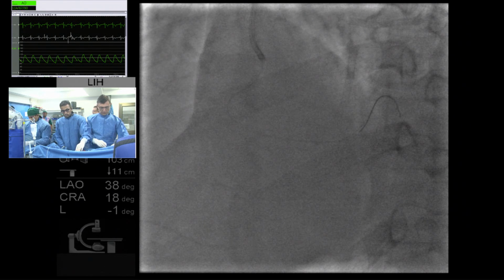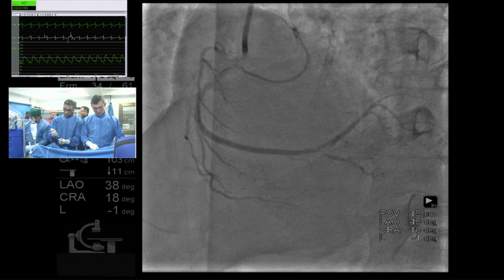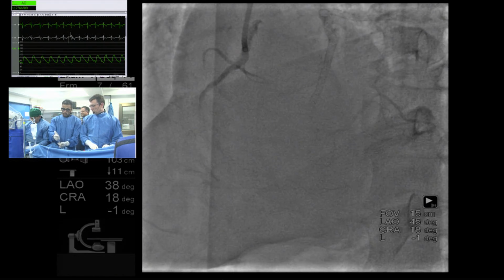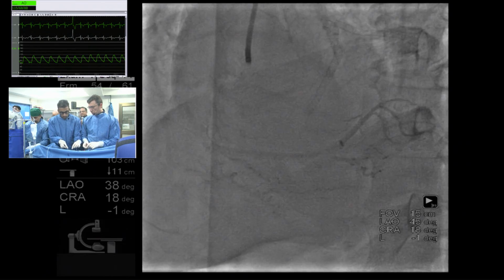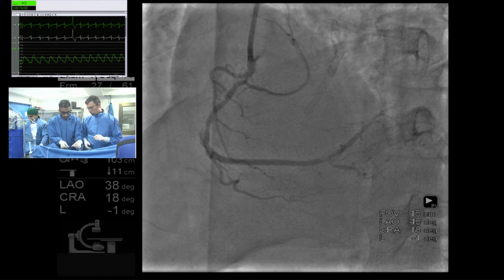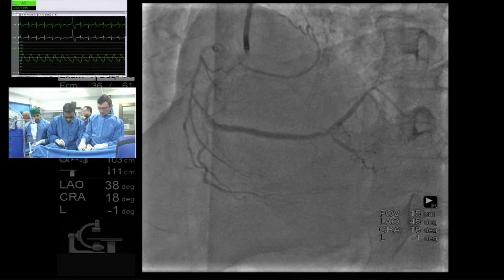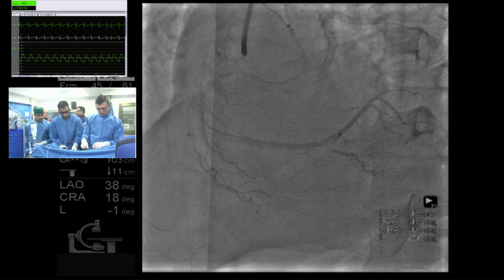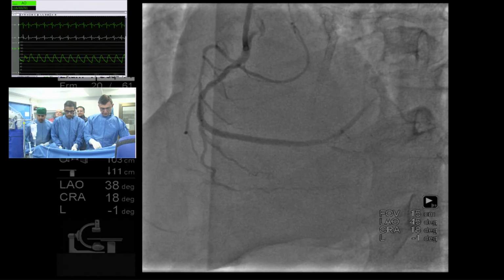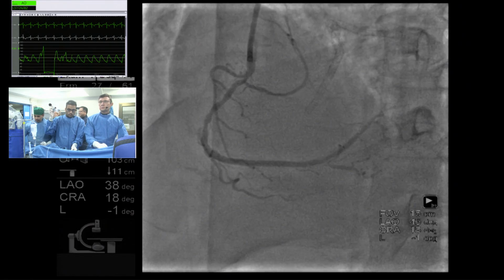So then you yourself will pick certain cuts and do manual measurements? Yes, I basically believe the automatic measurement, but it is very important to pay attention to the vessel shape and also the tortuosity, right? And when you put the cursor to that portion, if it is perpendicular to the vessel, it might be correct. Yeah. And if you can't identify the media or the EEL, you use luminal measurements?